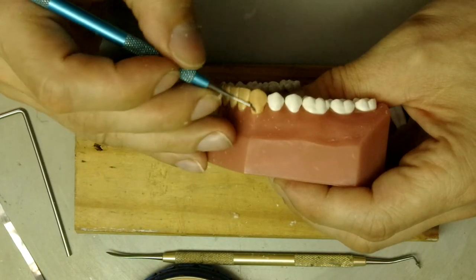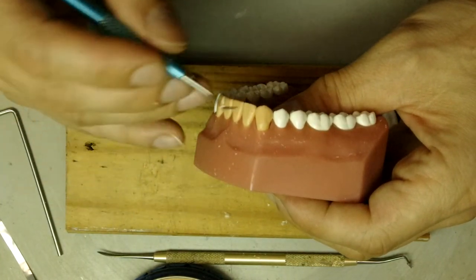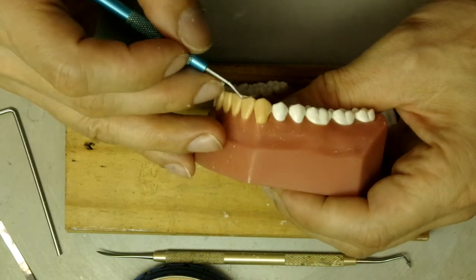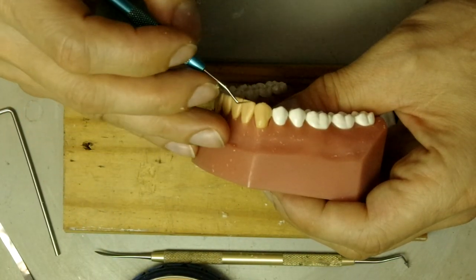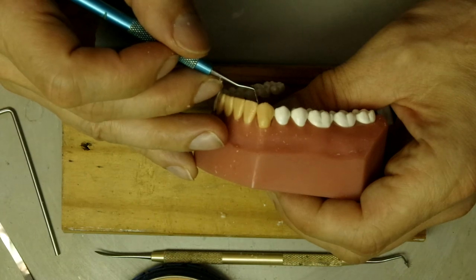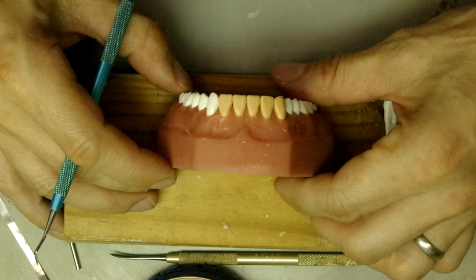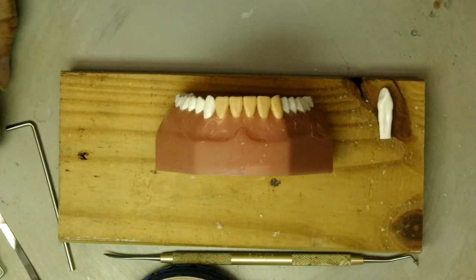So now you see the S-curve right here. That's what it should be like. There should be a little bit of a transition between this cusp and the lateral incisor. See, I was just a tiny bit taller than the laterals. And I kind of like it this way anyway, to have the point angle slightly lower than the distal point angle on the lateral. So there we go. You see? It's a nice match. And that's number 22.